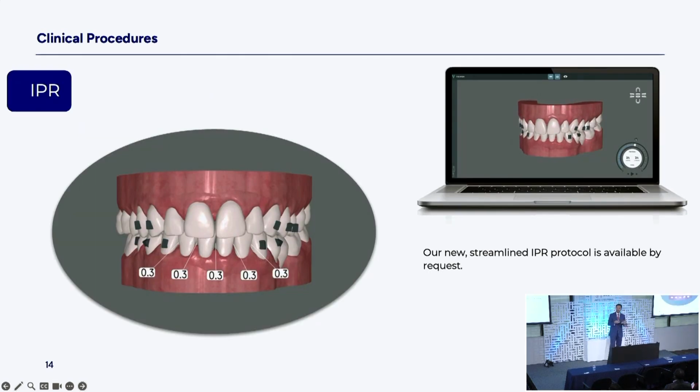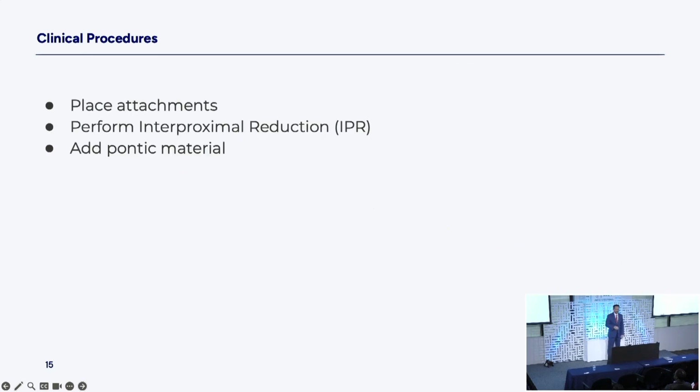IPR is part of a clear aligner technique, and you will have some of it sometimes, maybe restorative cases, comprehensive care, black triangles. There are examples we can throw out there. I try to avoid it at all costs like it's a plague, but it doesn't mean everybody has to be like that. But you may have some. We're going to show you how to utilize that nicely.